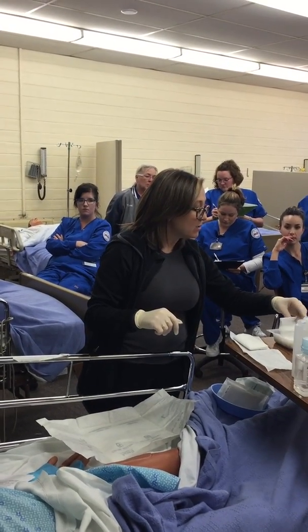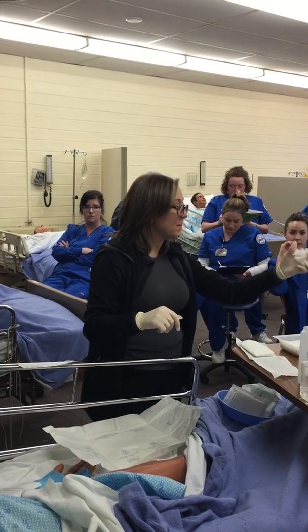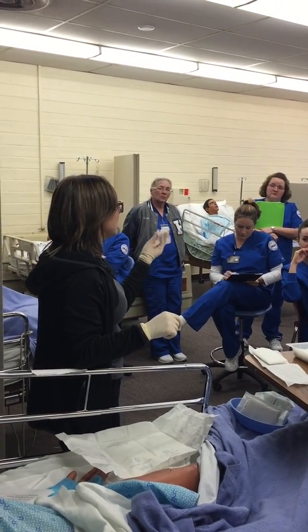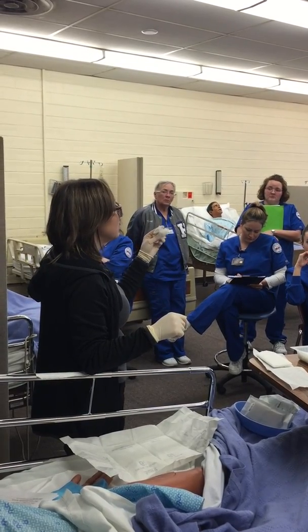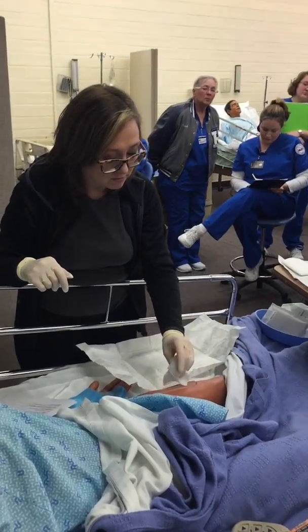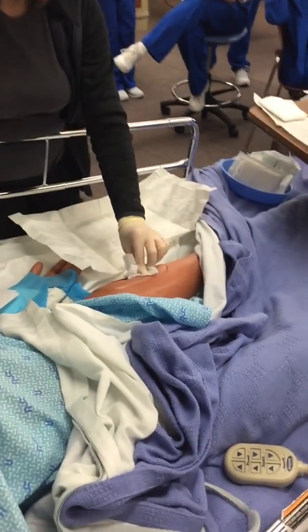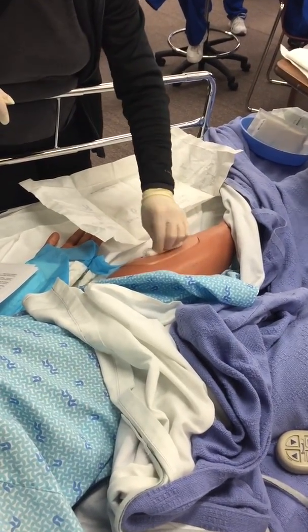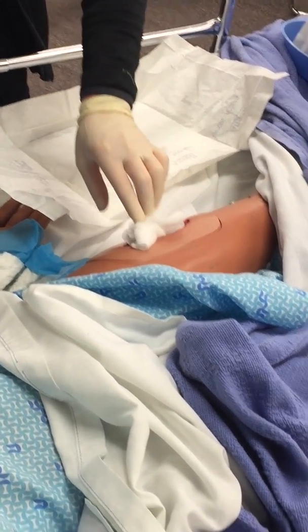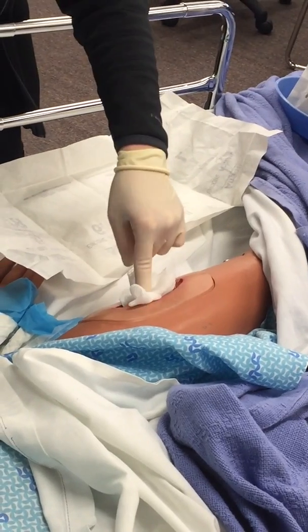When you pack these and you take them out, you need to come straight up and you bunch them up like this. Please do not try and fold these to make them neat. If you're OCD people and you like to have this all neat like I do, get over that. Just bunch it up. And you're going to stick them in here, okay? However you want to put them on there. And they'll usually stick into the wound. If you're doing a wet to dry, it's going to stick into the wound, okay? Don't touch in there.